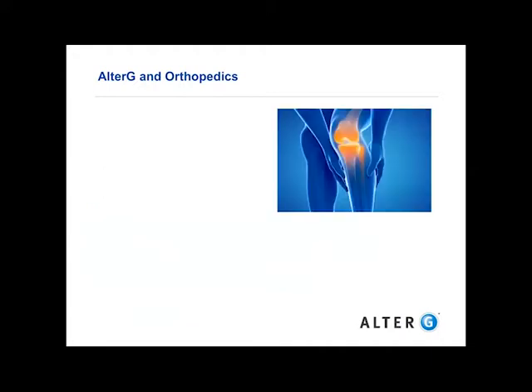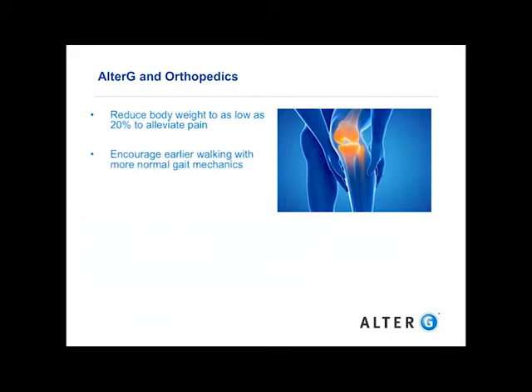So in orthopedic populations, we can reduce body weight to as low as 20% to alleviate pain and encourage mobility and movement. We can get people walking sooner to get them back to those normal gait mechanics, all while preserving the healing, protecting the healing tissue.